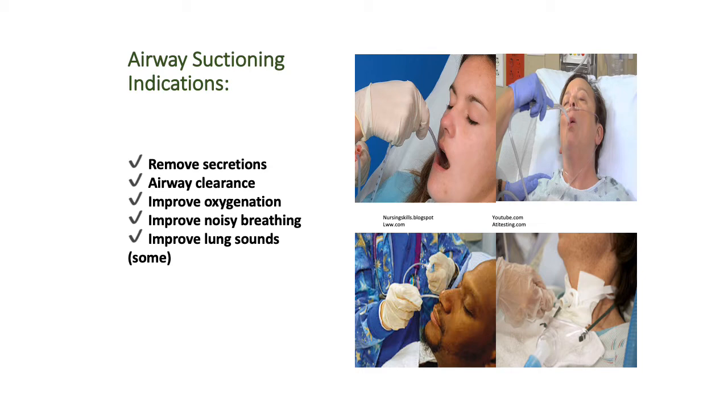And this is important because if secretions aren't removed from the patient, they're more likely to be aspirated deeper into the lungs, which increases a risk for infection, respiratory failure, and ventilator associated events if the patient is on a ventilator.